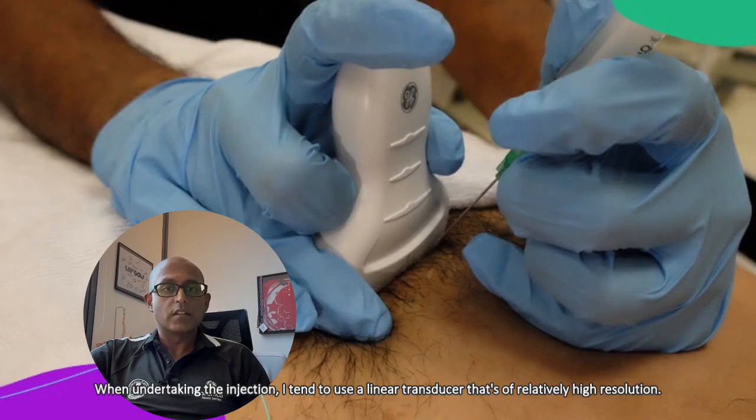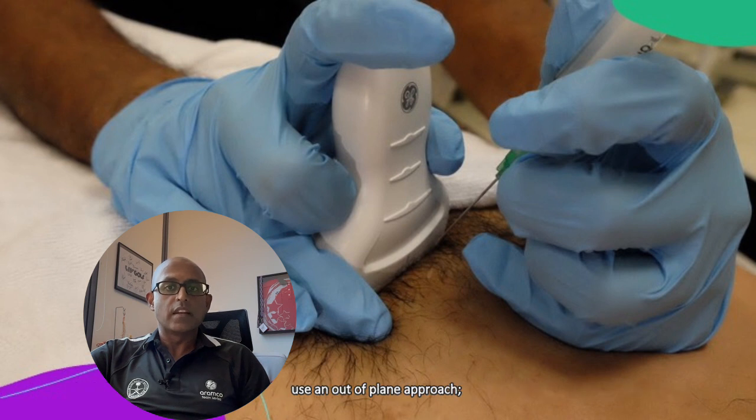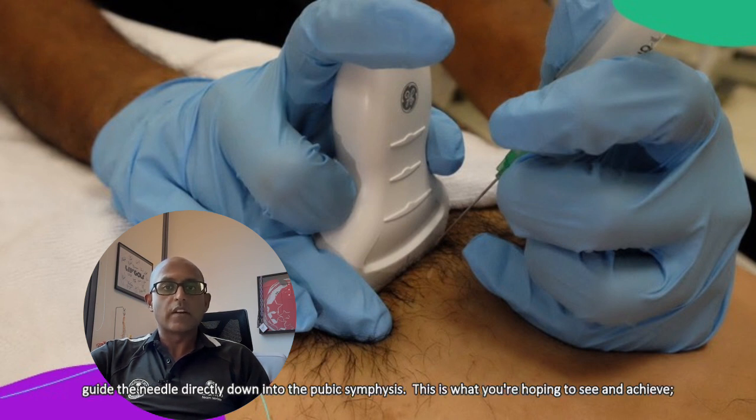When undertaking the injection, I tend to use a linear transducer that's of relatively high resolution, because you want to see the anatomy as clearly as possible. I tend to use an out-of-plane approach — bringing the needle perpendicular to the skin and as close to the transducer as possible, guiding the needle directly down into the pubic symphysis.